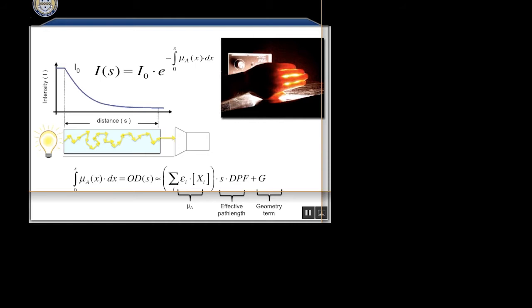So typically in the NIRS community, we always talk about the modified Beer-Lambert law, and I think the NIRX software even has this term of DPF, and they put a value of 6. The problem is that doesn't account for this partial volume term. So when you're estimating and you put 6 for DPF, you're actually overestimating the actual brain response.